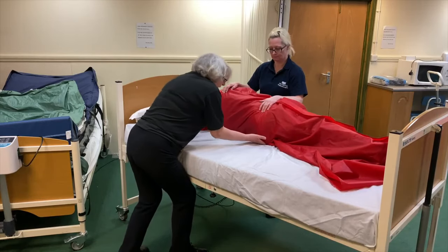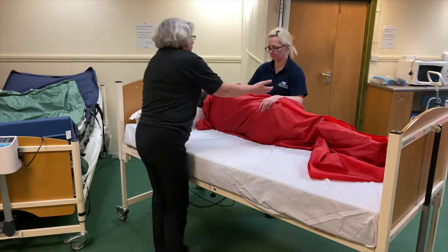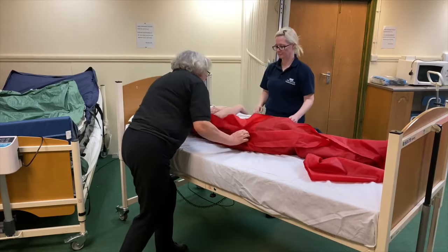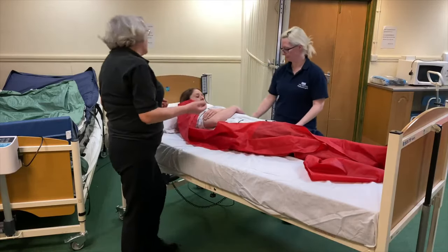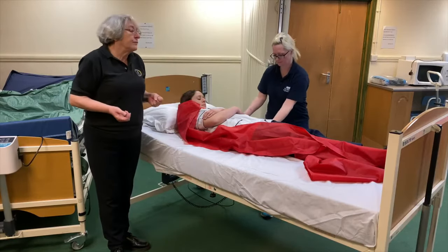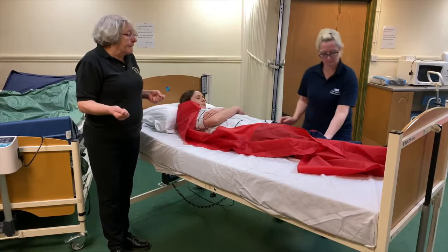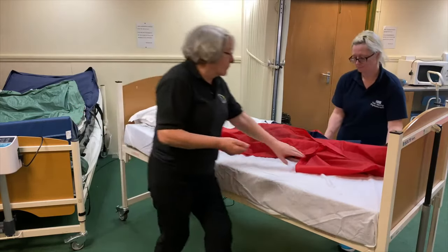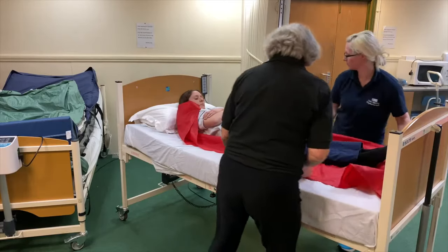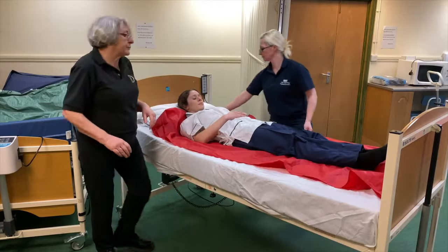Okay, using the flat of my hand coming in contact with the body, and then when she rolls back to me, very gently, all Lisa has to do is unfold the leaves underneath, so it's in place. So we have the slide sheet underneath her.